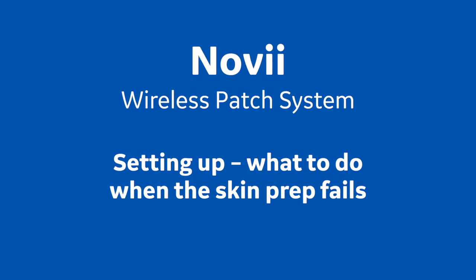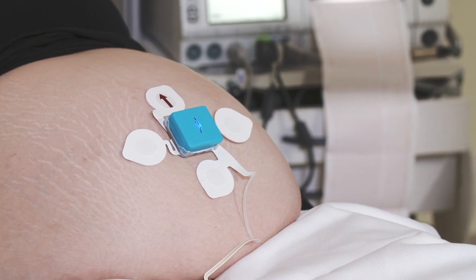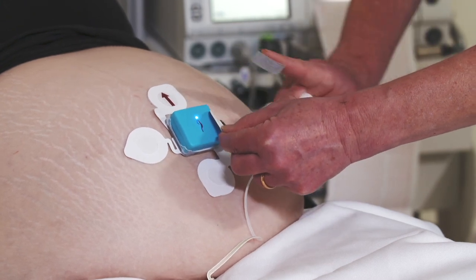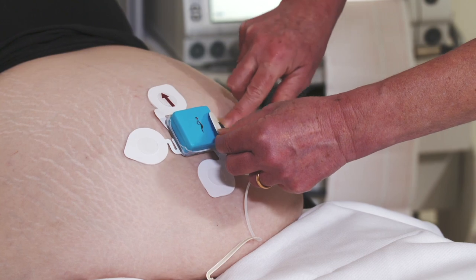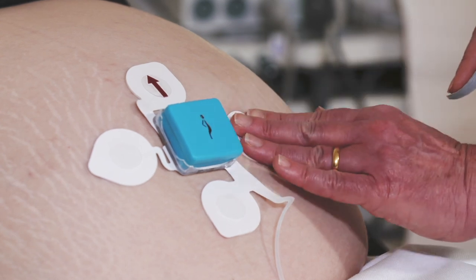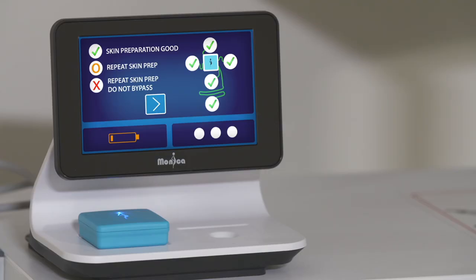Training Session 4: What to do when the skin prep fails. You have done the skin prep as directed, and yet the skin electrode check screen is showing that one or more electrodes has not passed the skin electrode check and a red cross or orange O is being displayed. You should not bypass a red cross if it can be avoided, so peel back the problem electrode and wipe the skin dry to remove any excess electrode gel. Any residual gel left on the skin will prevent the electrode from sticking back down securely. Re-exfoliate the skin over the same spot, pressing firmly to ensure placement is accurate over the center of the cross. If successful, the red cross will turn to a green tick and monitoring will commence.